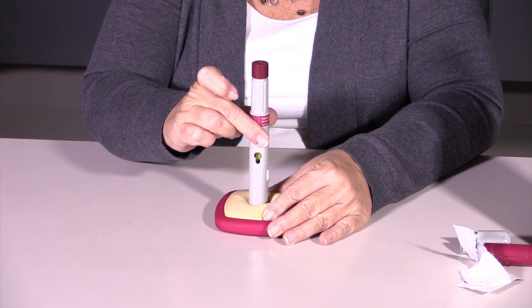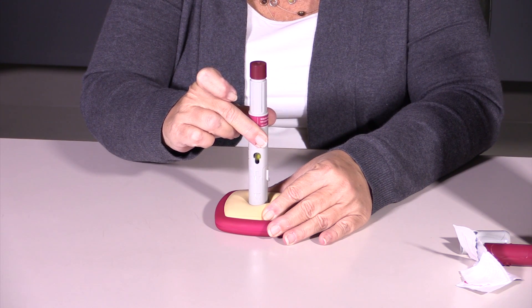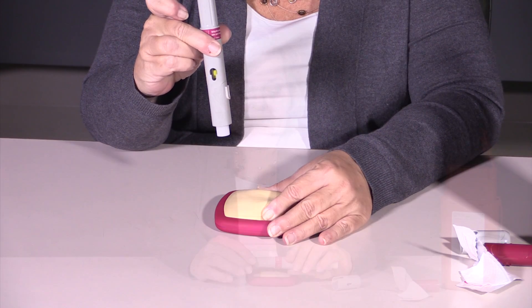We watch that yellow indicator come down. Once that has stopped moving, we take the pen away. You're going to deposit the pen into your sharps container, and that's all there is to injecting Humira.